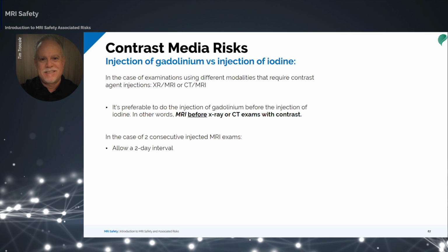If a patient is having two MR exams, both requiring injection of gadolinium, a minimum of 48 hours should separate the two studies.